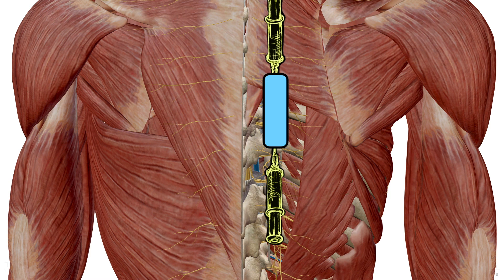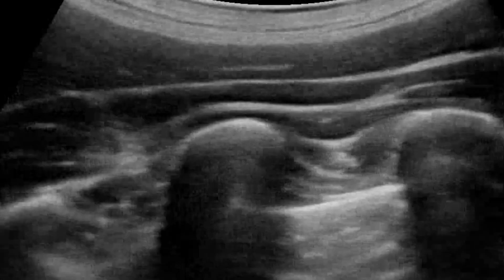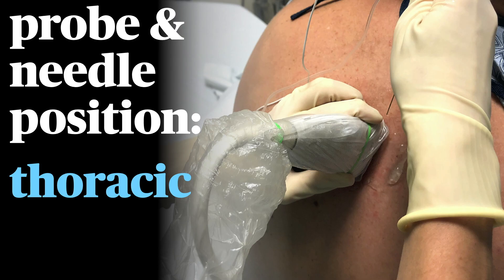You can use surface landmarks to estimate the T5 or T10 transverse processes, but since you have your ultrasound handy, you can slide up to the first rib — and we know it's the first rib because there are no more — and then count down until we get to the appropriate level. These blocks are simple to do in several positions, and the images are identical with the patient sitting, prone, or lateral.